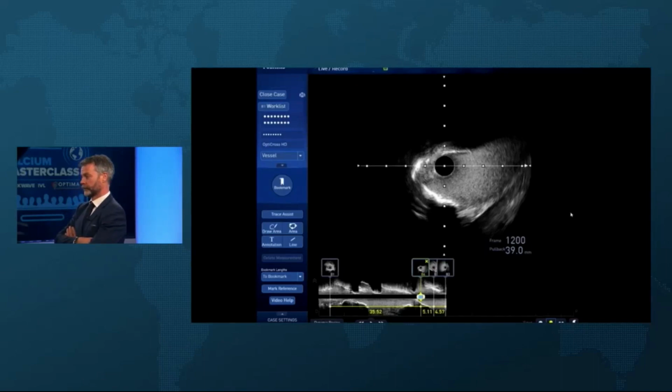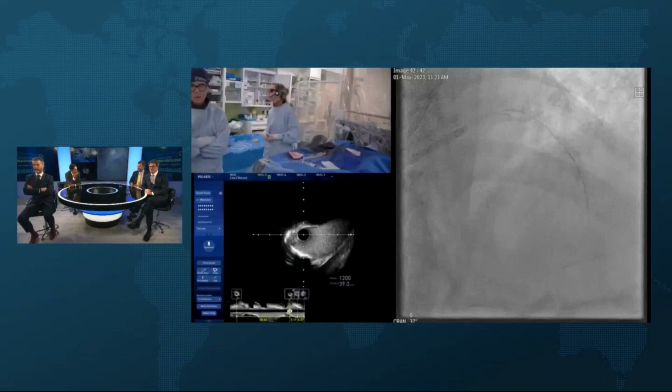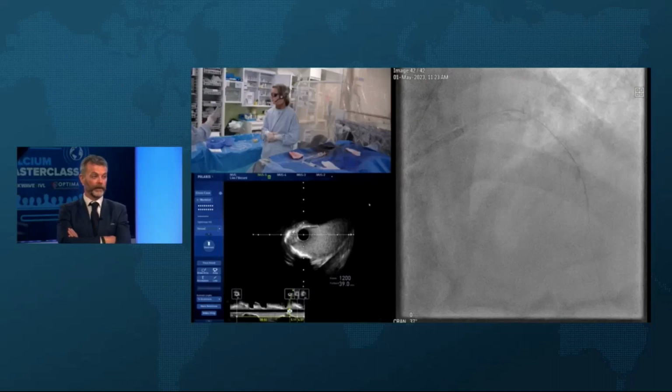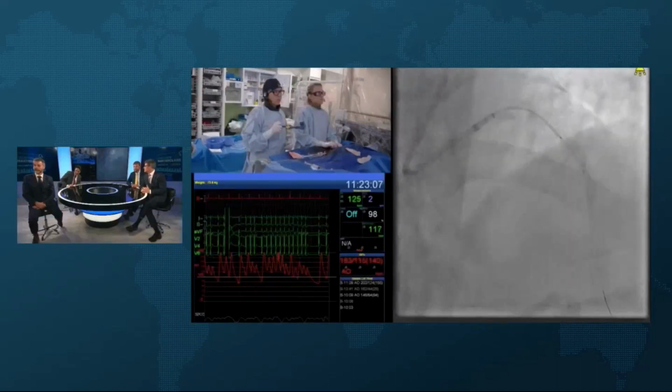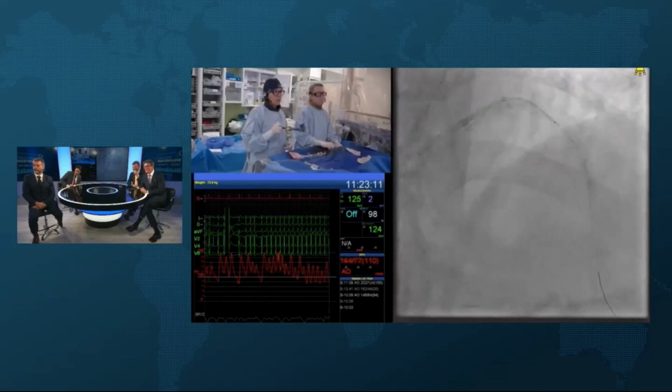I mean, stenting to the ostium. Yeah, I mean, you've got at least 4 millimeters overlap in this situation, which is a nidus for stent failure, isn't it? And you've also got the ostium of the left main to deal with, which you don't need to really. So if we have any problems getting this down, even with the guide extension, we can re-deliver the balloon and track the guide extension back in if we need to.